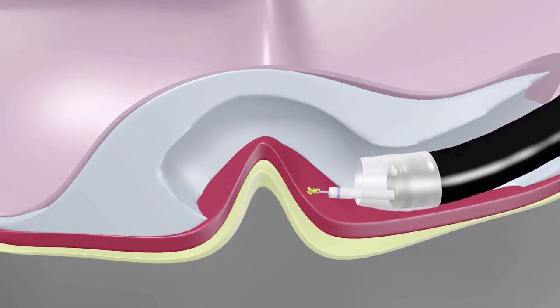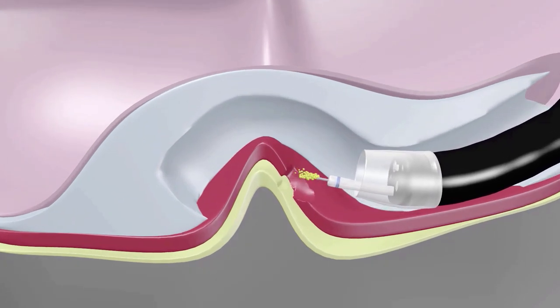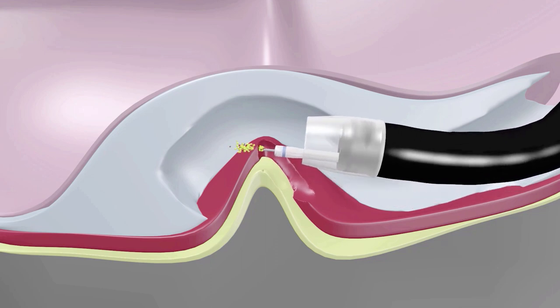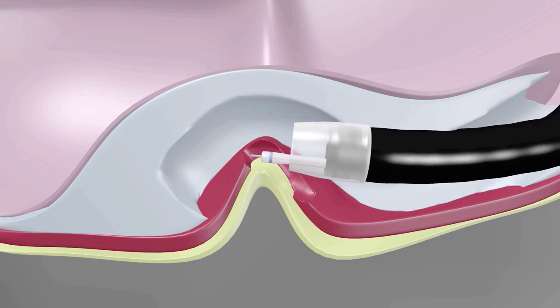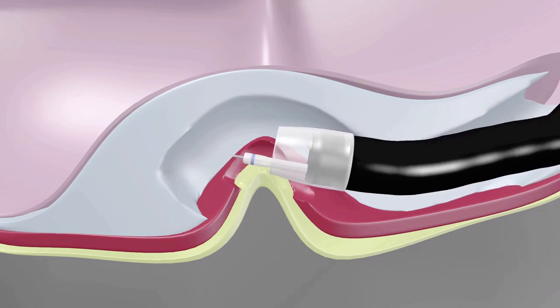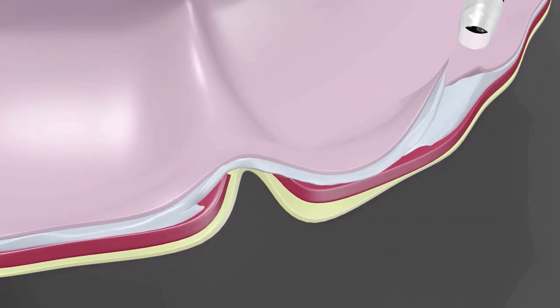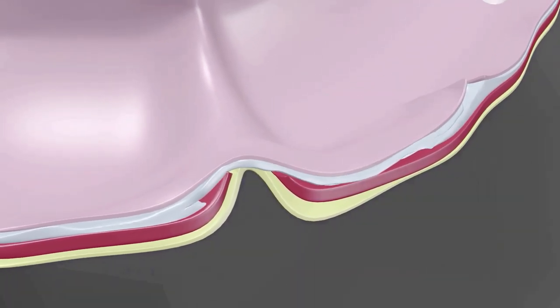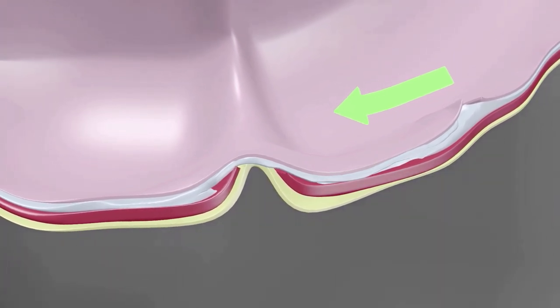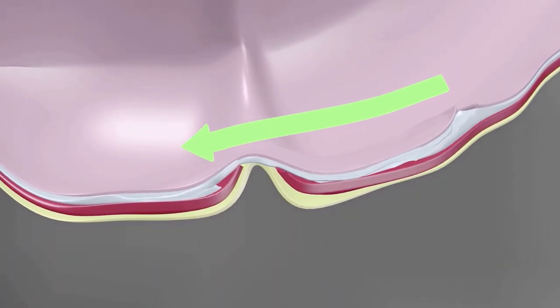After the submucosal tunnel, we perform the Stricturotomy, cutting the residual scar tissue and the involved muscular fibers. After the Stricturotomy, the stricture is no longer visible, allowing the passage of food and fluids.